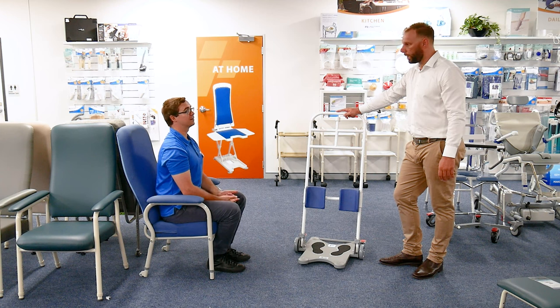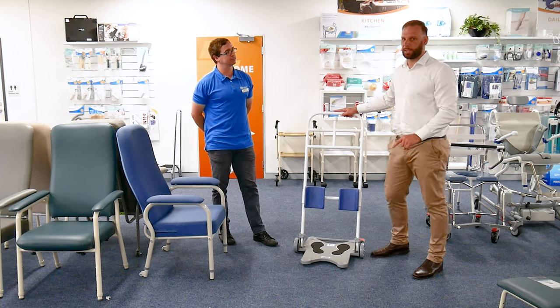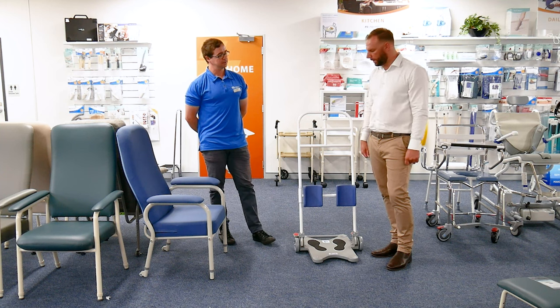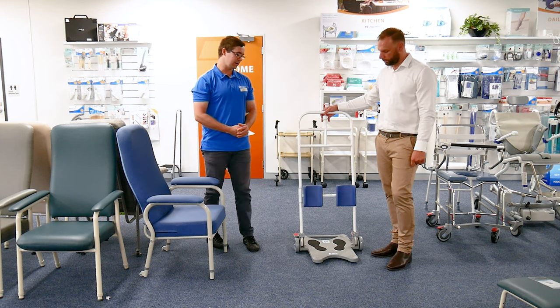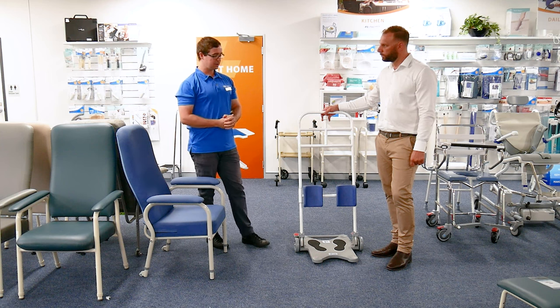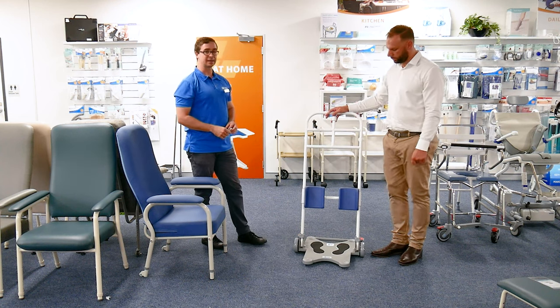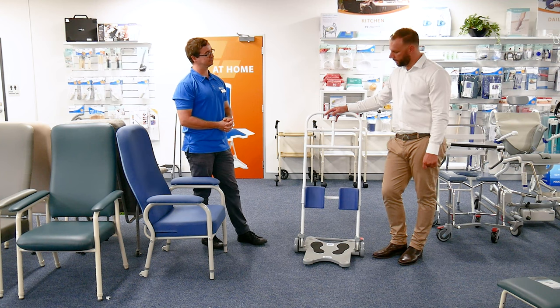A very key point where we sometimes hit snags, particularly in the home environment, is the flooring and carpet puckering. A key tip is knowing that you can look at some sort of rubber overlay — clear or opaque, but from our experience a clear, large, heavy rubber overlay is able to negate that carpet risk in most environments.